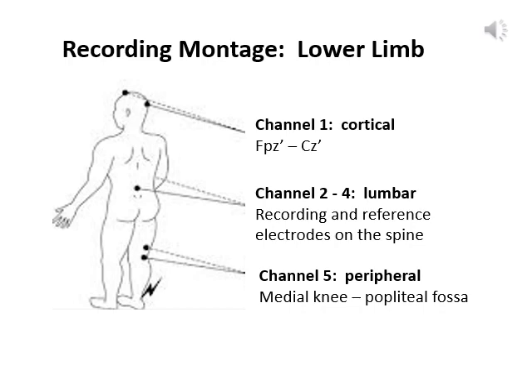Typically, there are 2 or 3 lumbar channels, which usually consist of pairs of electrodes along the spine, with the lower electrode being the recording electrode and the higher electrode, that is the one closer to the head, being the reference electrode. These active electrodes could be placed at L3 spine, T12, or T6 spine. The references could be placed 3 to 4 centimeters above the recording electrode.